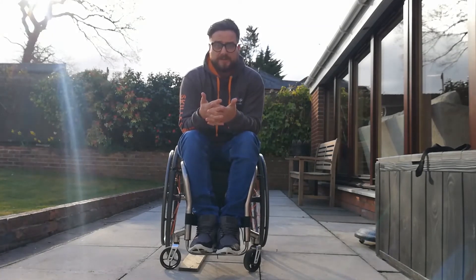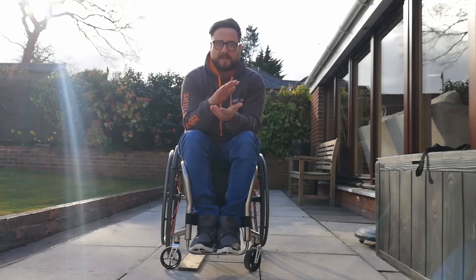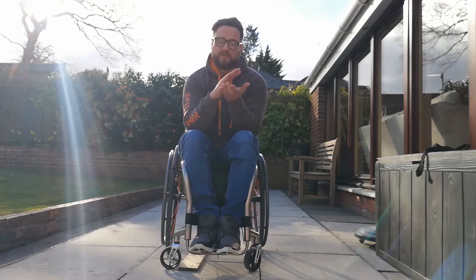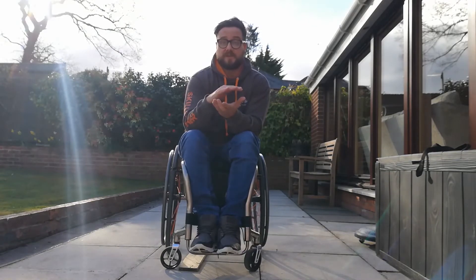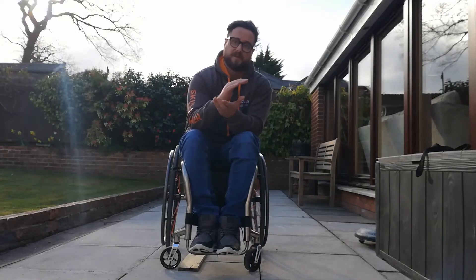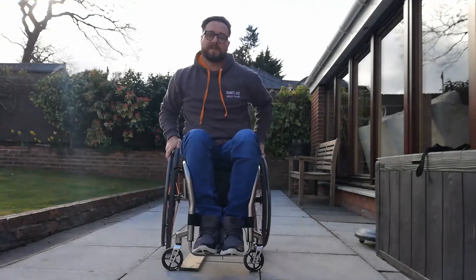Negotiating a threshold, in a nutshell, is getting over an obstacle in a back wheel balance the entire time. The way we go about this is getting up into our back wheel balance, nice and comfortable, pressed against the object with our back drive wheels. Then from there, we pull away ever so slightly whilst dropping the front of the wheelchair and then it's a big push. We drop the front to allow for that big push so that we don't go too far backwards and lose our balance point. Then a big push to get up and over whilst maintaining the back wheel balance the entire time.